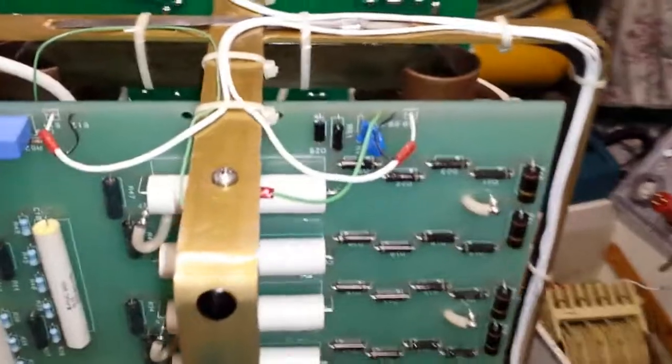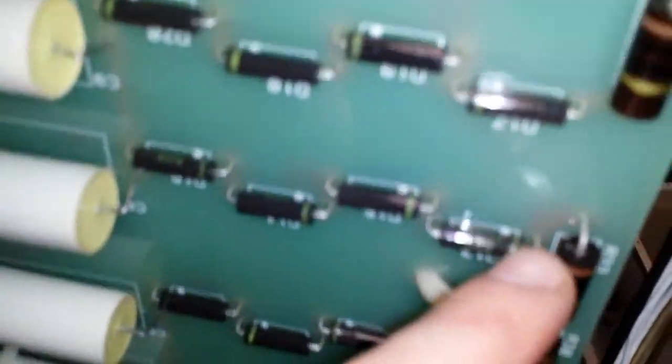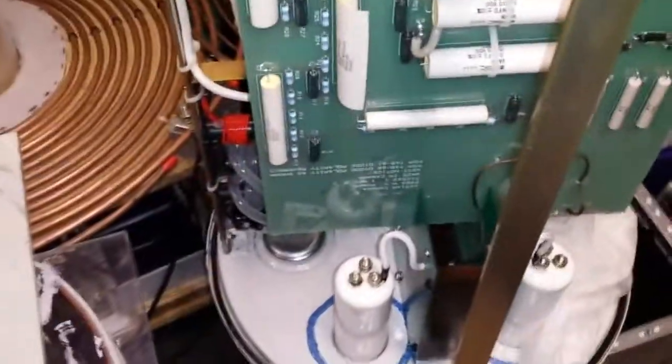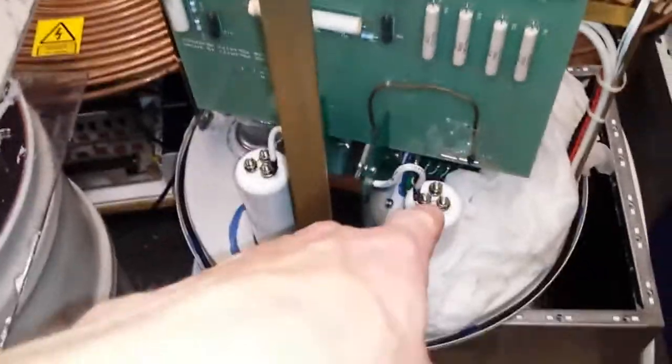I can't see it. I'd have to put that reading into Google to actually see the amount of what these will take. But yeah, the Federals are nice on this. I do like the Federals on this.